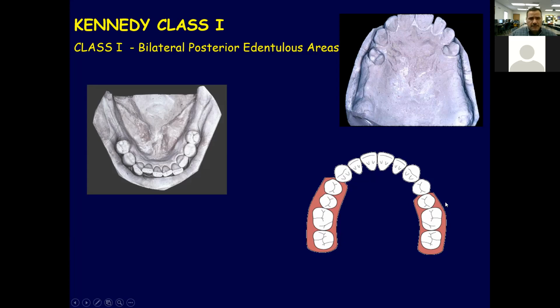You know, in prosthodontics in dentistry in general, we don't replace wisdom teeth. You can see they replace first molar, second molar. There's no third molar. You know why, Ashley?